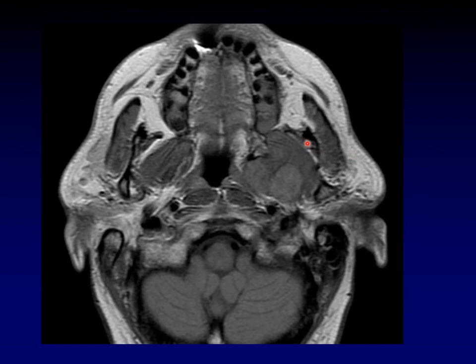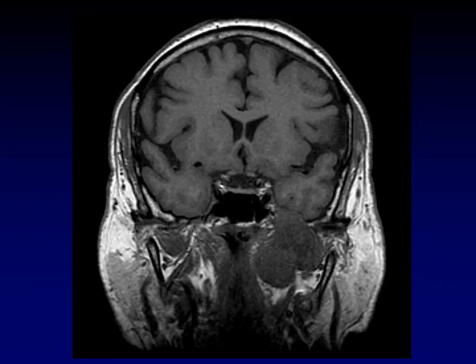Here's another mass in the masticator space. Look how it is compressing the parapharyngeal fat, pushing it posteriorly and medially. We're within the muscle, and although there's nothing on the axial images that will clearly tell you what kind of tumor this is, the coronal image gives us a clue: this tumor is knuckling up through foramen ovale and spreading down into the infratemporal fossa. This is a schwannoma arising from V3.